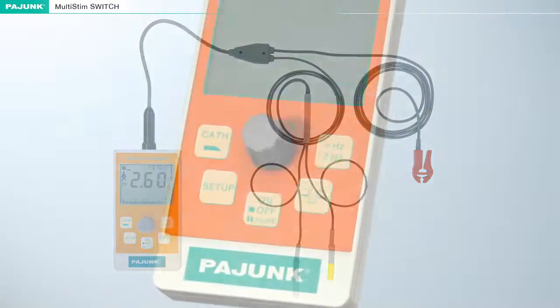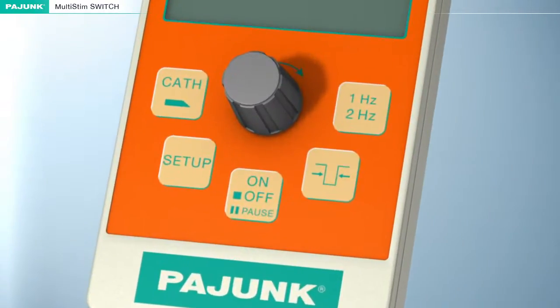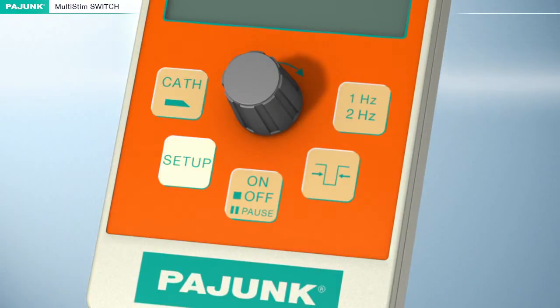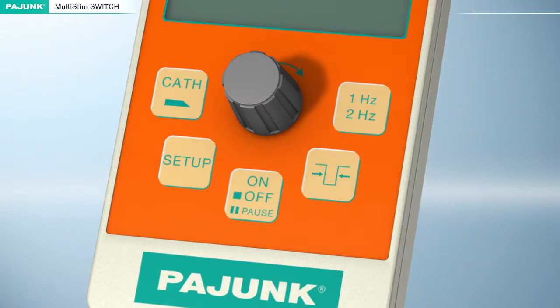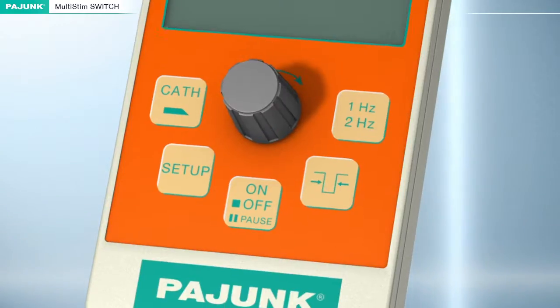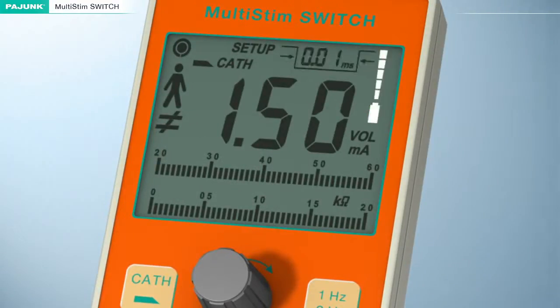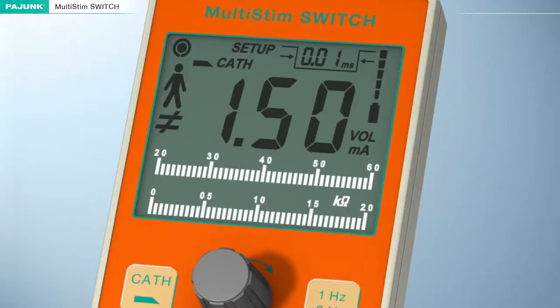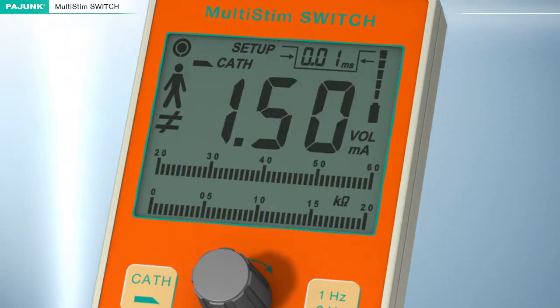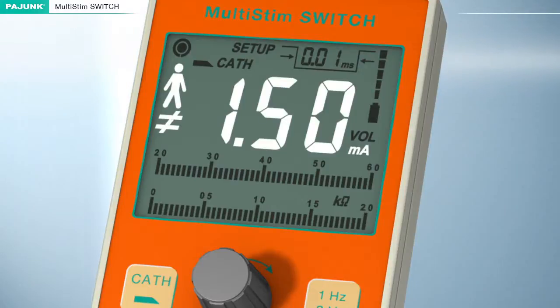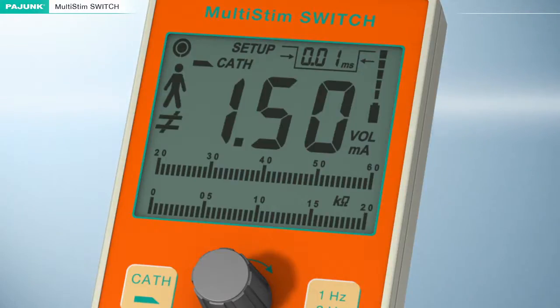The nerve stimulator has five control keys, toggling between cannula, catheter, setup, on/off, pause, impulse bandwidth, 1 Hz, 2 Hz, and a turning knob. The digital display indicates the following: impulse bandwidth, battery condition, patient resistance, current intensity, actual patient current, active output, and impulse emission.